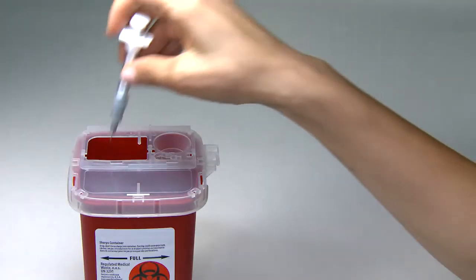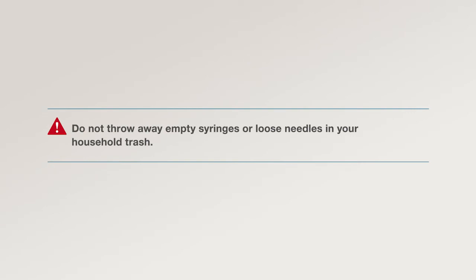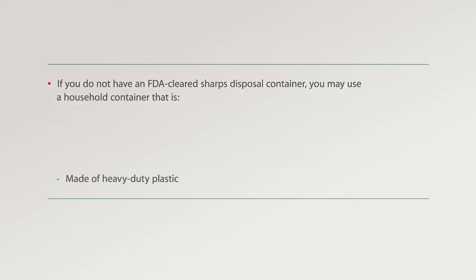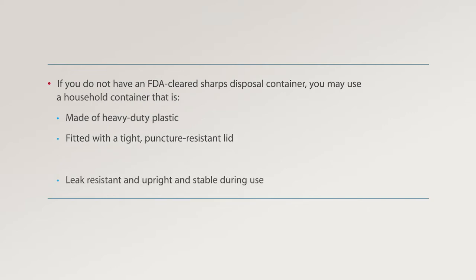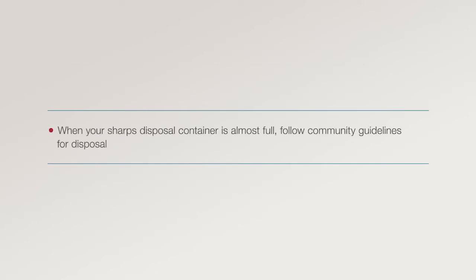Step 4. Disposal. Discard the empty syringe and used needles in an FDA-cleared sharps disposal container right away after use. Do not throw away empty syringes or loose needles in your household trash. If you do not have an FDA-cleared sharps disposal container, you may use a household container that is made of heavy-duty plastic, fitted with a tight, puncture-resistant lid, leak-resistant, upright and stable during use, and properly labeled to warn of hazardous waste inside the container. When your sharps disposal container is almost full, follow community guidelines for disposal.